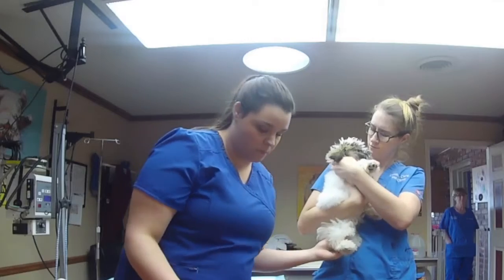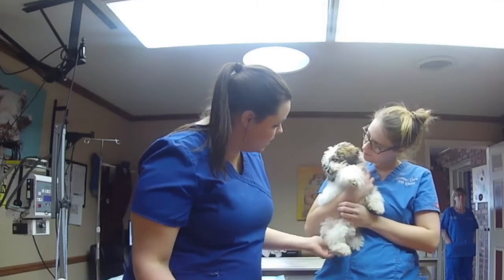Oh, and then we will follow up with isoflurane gas when he is on the table.